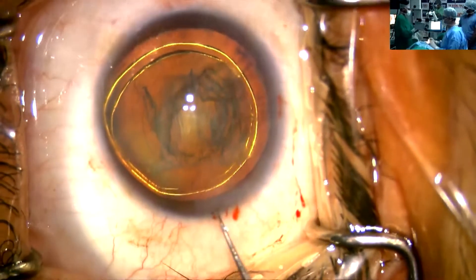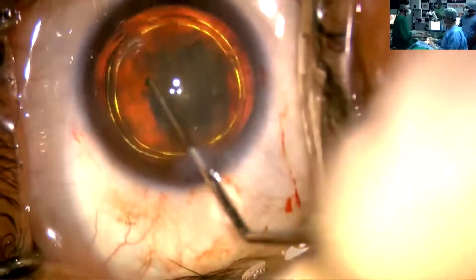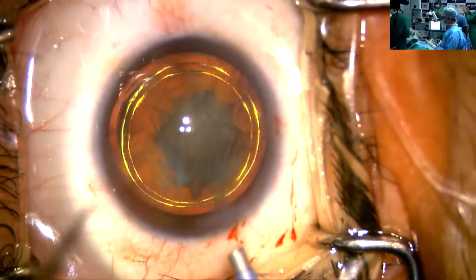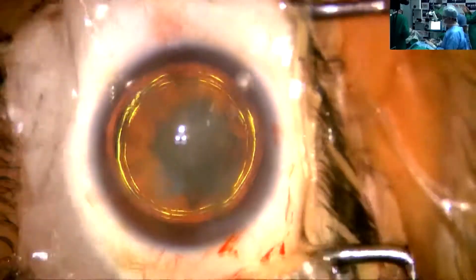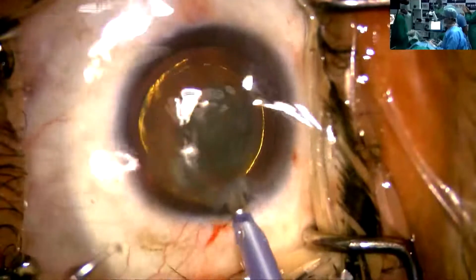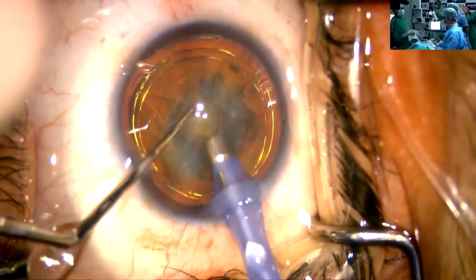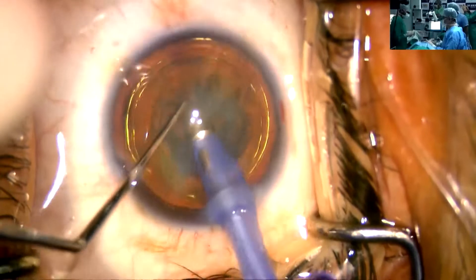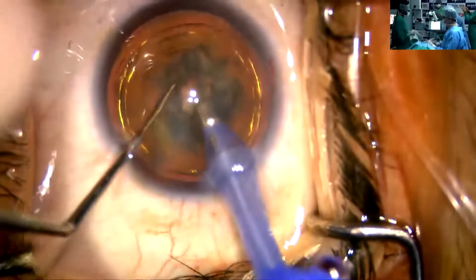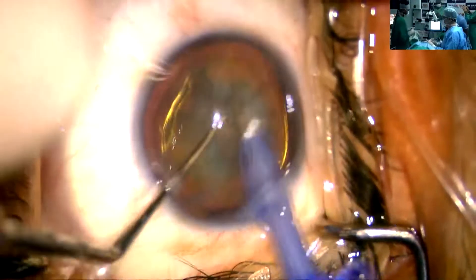The machine I am going to show you is a beautiful machine. You can just press the foot pedal and forget the rest — there is no surge in the machine so far. Now I will be doing on the continuous irrigation mode. You can see this is a very good handpiece, very comfortable to use, thin handpiece — even thinner than the Alcon machine. The suction is around 400 and you can still see the chamber stability. Hardly any phaco is required, but you can see the chamber stability with this machine.